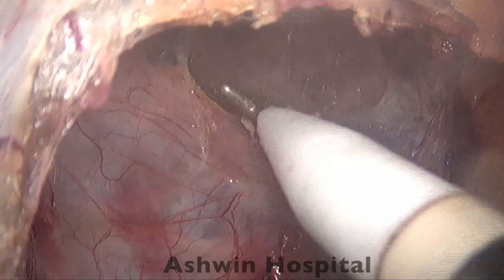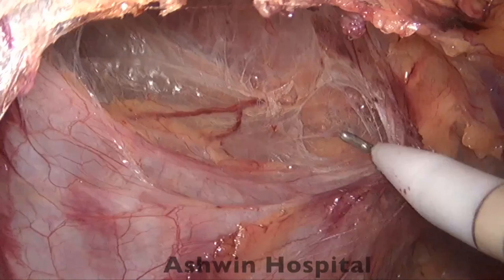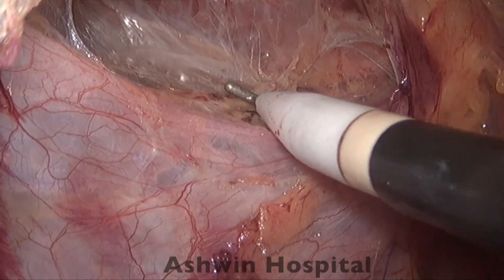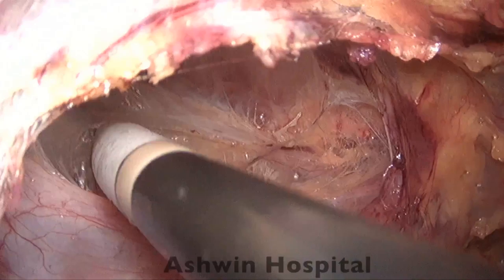So now you can see the area where the peritoneum is turning into the sac also is nicely visible. And all this dissection has been done with just one working port. We have not really made a second working port yet. So till whenever we are comfortable, we will carry on with our dissection like this. But generally, if we have opened the Bogros space a little like this, then we'll be more than happy with the dissection, and we will go and concentrate on inserting the second port.